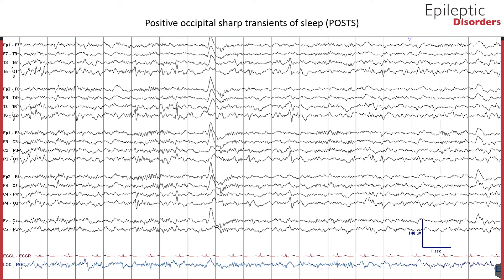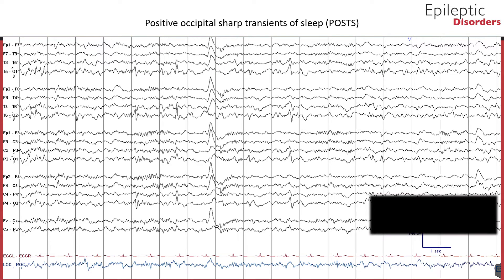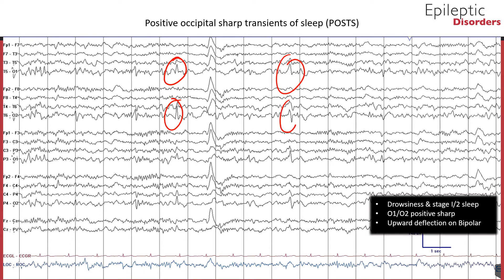POSTS are another important physiologic potential that becomes more apparent in deep drowsiness and persists during light sleep and deep sleep. It is most commonly found in adolescents and young adults, and these potentials are found in about 50% to 80% of a healthy adult population. In this bipolar montage, you can see POSTS outlined in red in the O1 and O2 channels. Also note in this montage, K-complexes outlined in the red square, as well as sleep spindles starred, suggesting that this is stage 2 sleep.